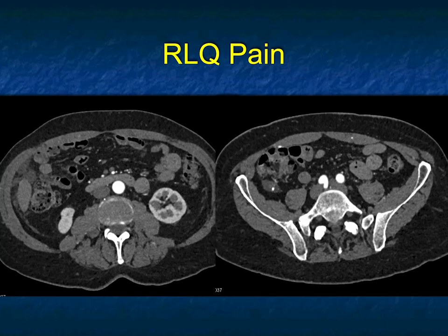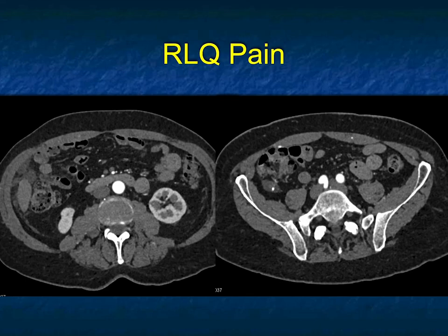Mass, probably appendix, calcification — could be appendicitis, could be just an appendicolith. But then you couldn't explain the implants on the omentum. This was a mucocele of the appendix, which commonly has calcification with omental implants. What a great case.